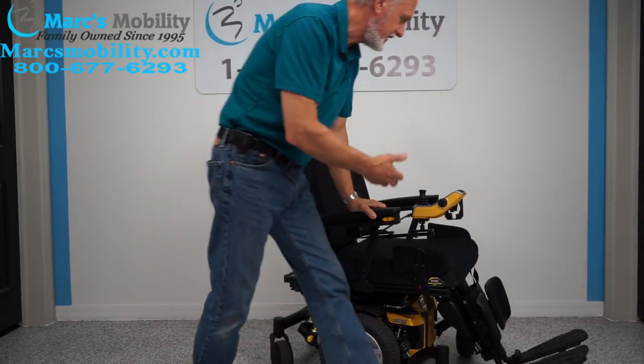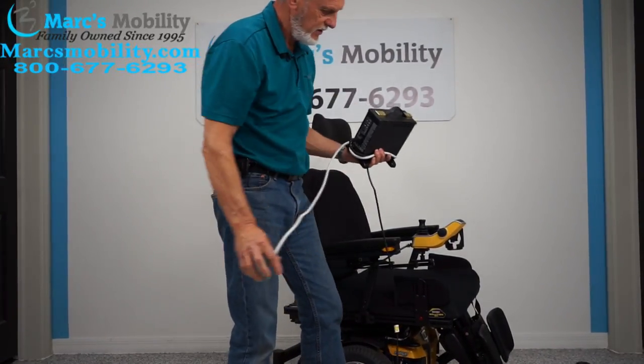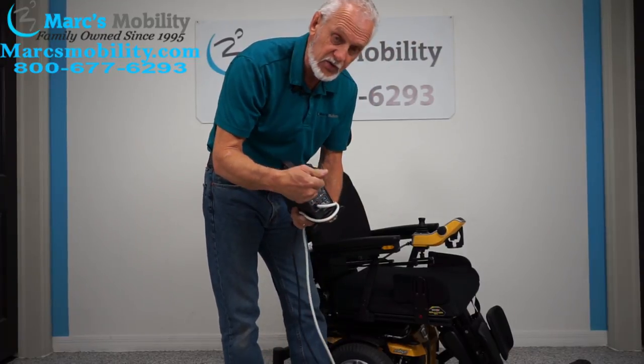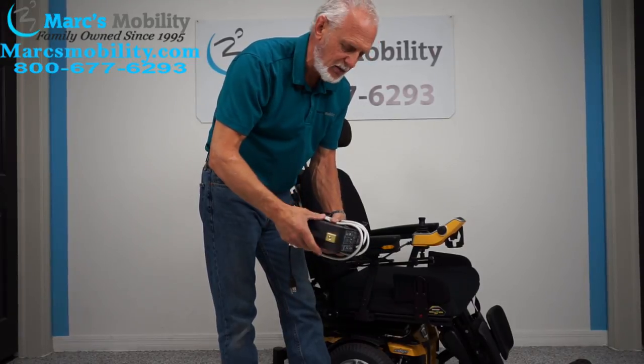It also has the reinforced arms. This chair has got everything you'd want in a heavy duty power chair. When you charge this chair, just take your charger and plug it in below your joystick. As soon as you go from orange to green, you're fully charged. These are smart chargers — they will stop charging when the batteries are full.